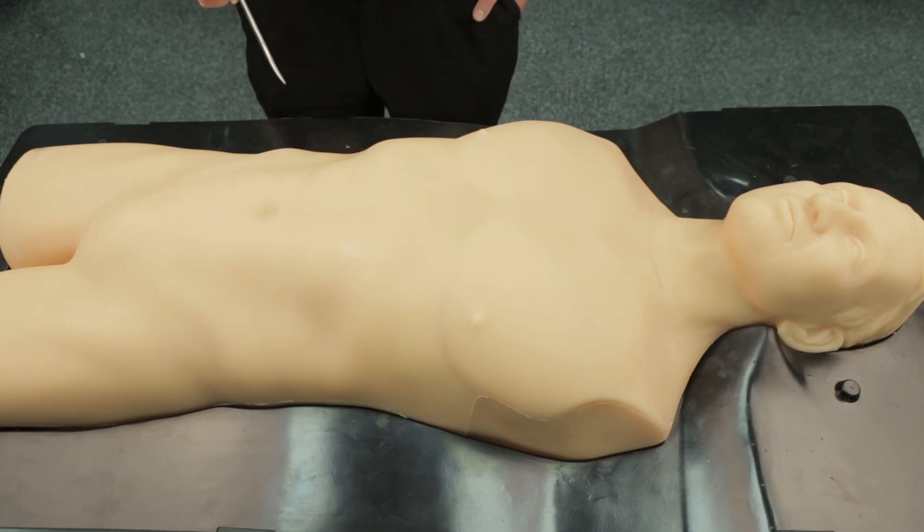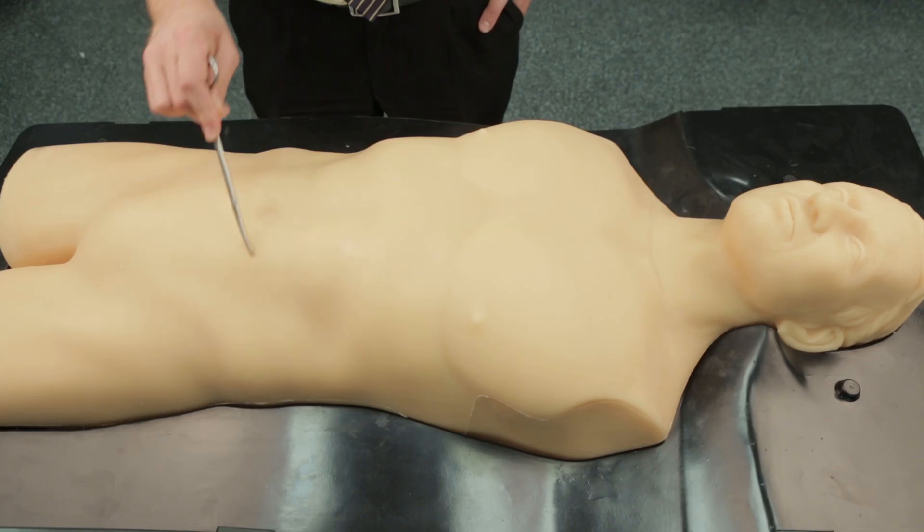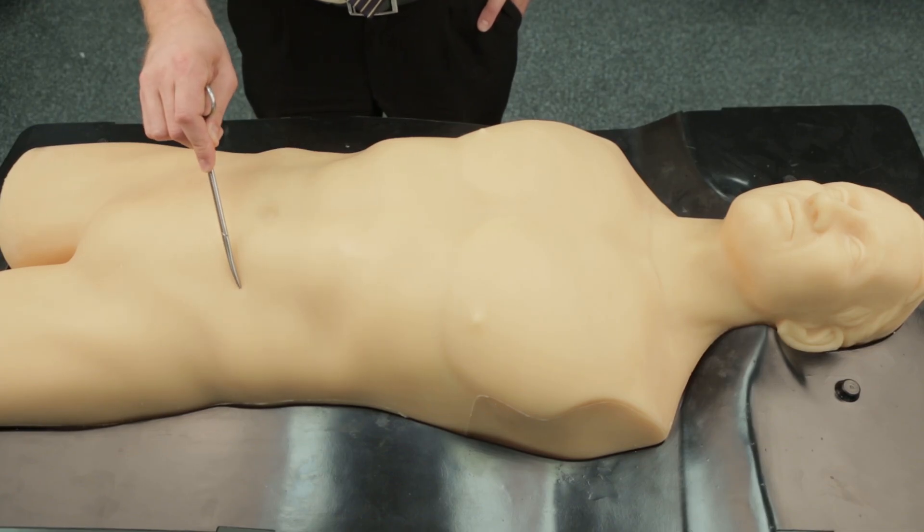Before commencing a colostomy or ileostomy, one must consider where to site it. The right iliac fossa is normally used for an ileostomy, demonstrated here, and the left iliac fossa is used for a colostomy, demonstrated here.